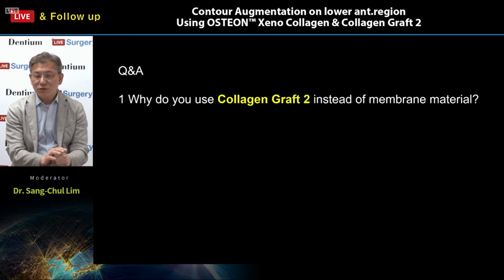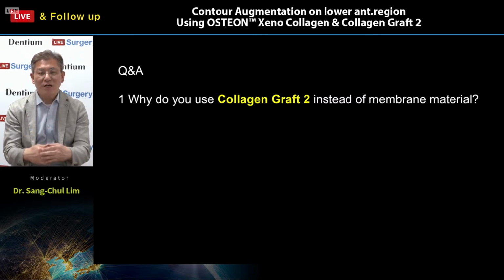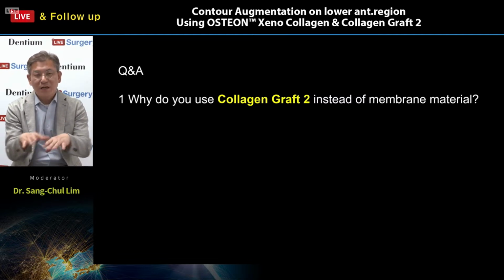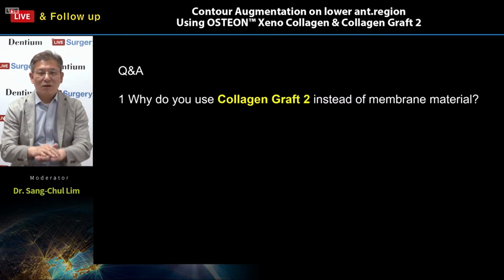And collagen graft 2 is a little bit different. This collagen graft 2 is a collagen matrix that works by promoting soft tissue healing, right?